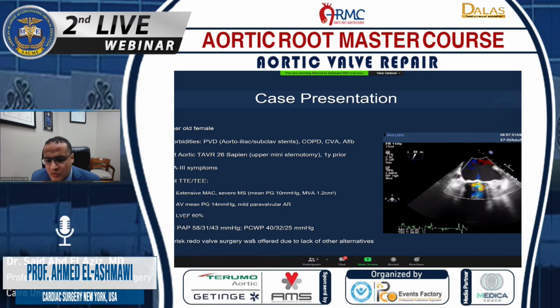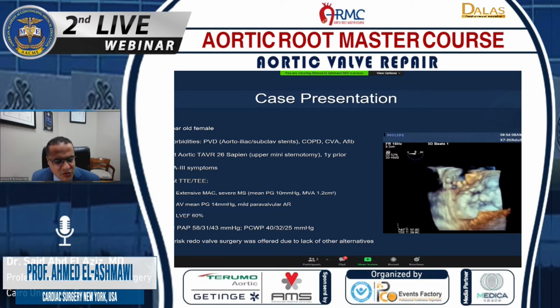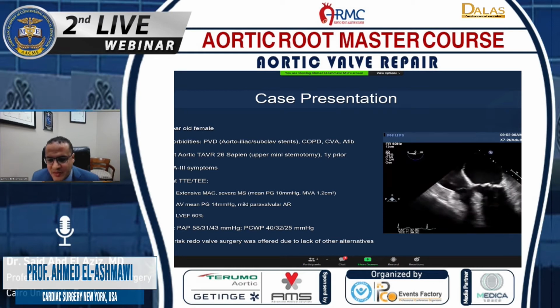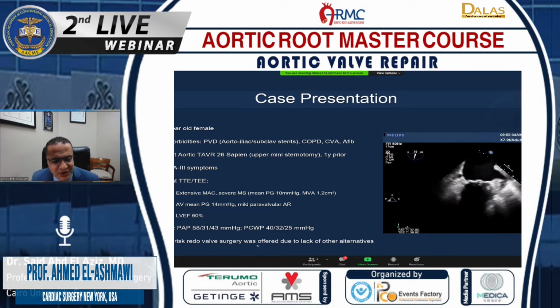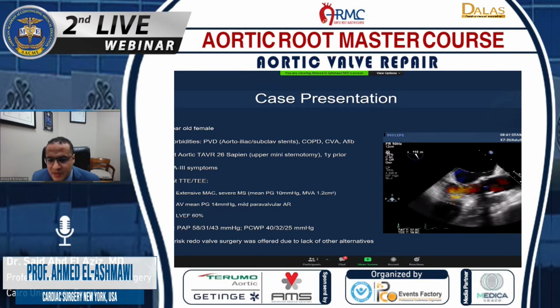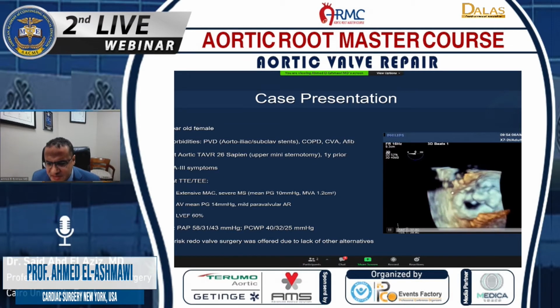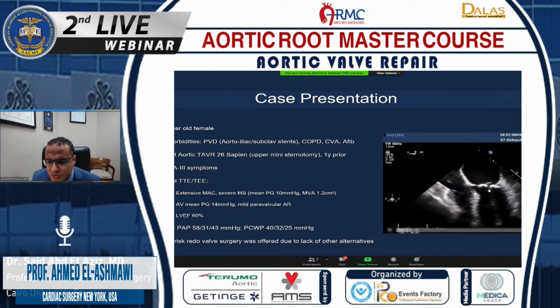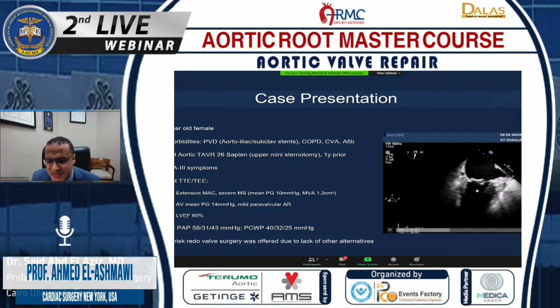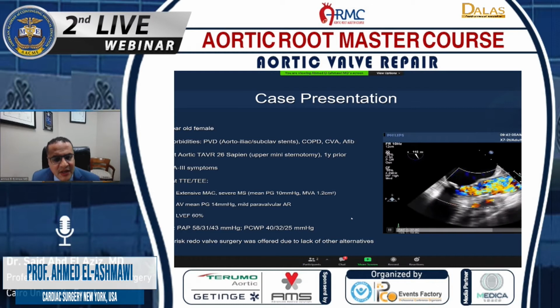Because we know there is no percutaneous intervention for this, and also we know the futility of medical therapy, with a high mortality even at 1 year for patients with severe mitral stenosis and pulmonary hypertension, we offered her a reoperation, basically to address primarily her mitral valve. But when you look at that echo, you can see a circumferential degree of MAC with calcification of the aortomitral curtain. So we did not expect an easy, isolated mitral valve replacement for that case.